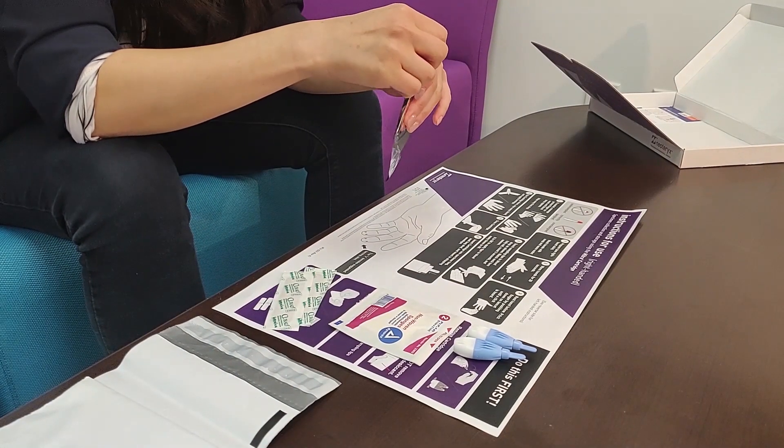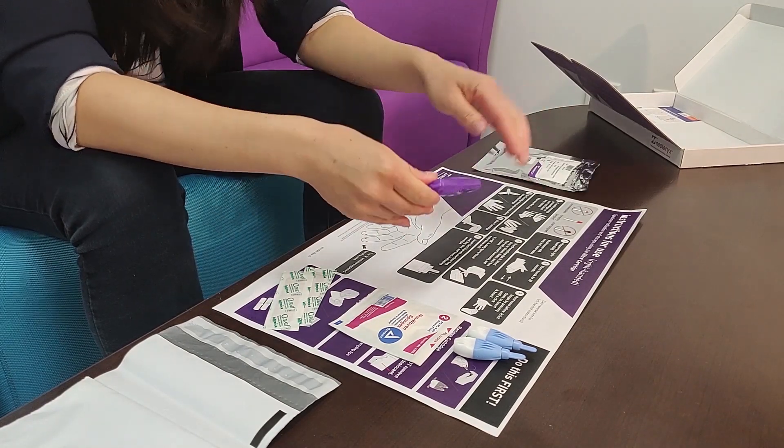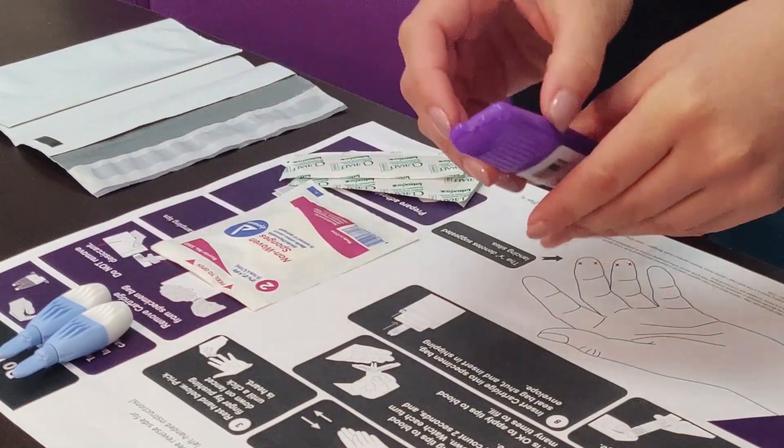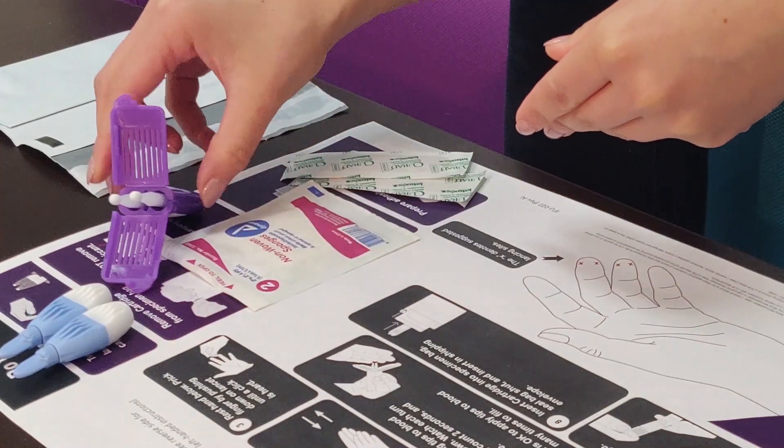First, remove the meter device from the specimen bag. Do not remove the desiccant; it should stay in the bag. Next, open the meter device to expose the sampling tips. Do not remove the microsamplers from the cartridge.